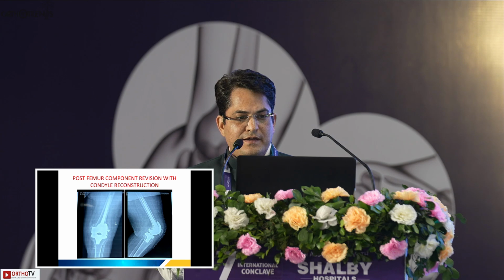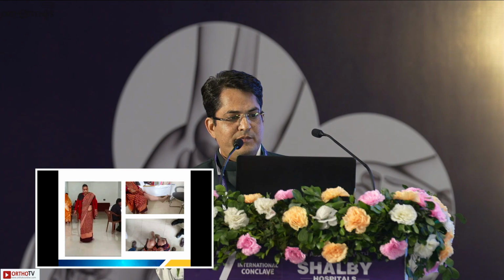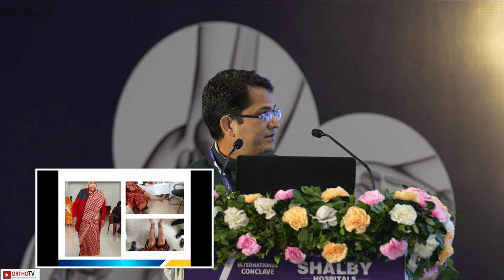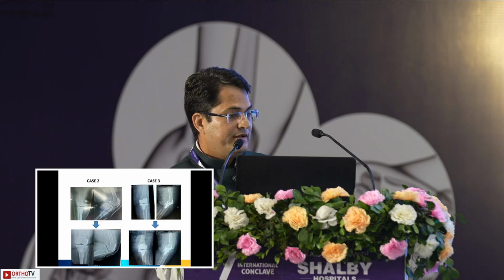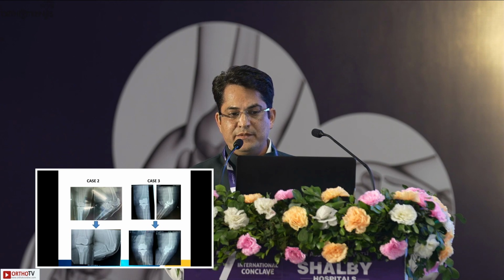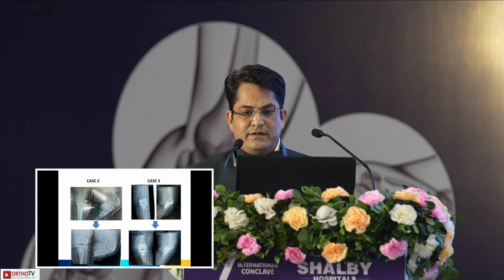This is the first follow-up, then 2 months follow-up, 3 months follow-up, and she is able to walk. She has a good range of movement and good alignment. Cases number 2 and 3 have a similar kind of periprosthetic fracture of the femur, highly unstable.